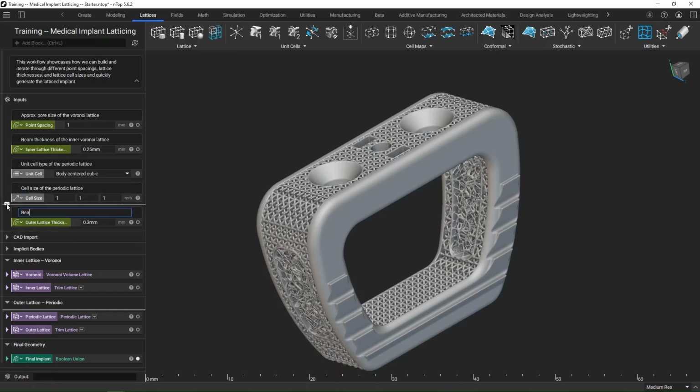And then beam thickness of the outer periodic lattice. And so these might be things that are very familiar to you right now. You've just gone ahead and built this whole workflow.